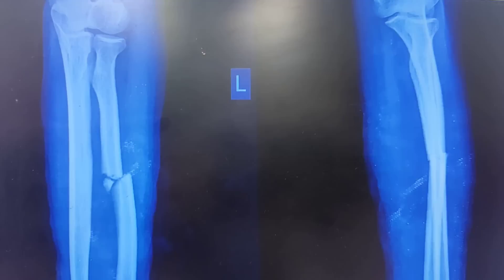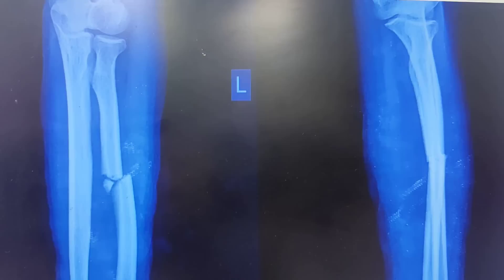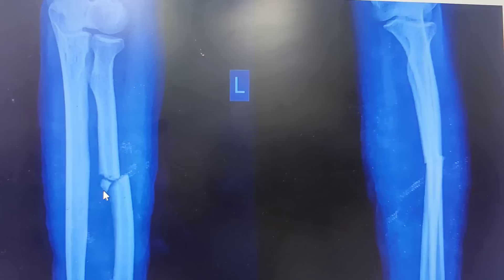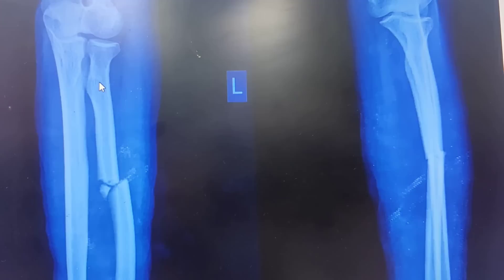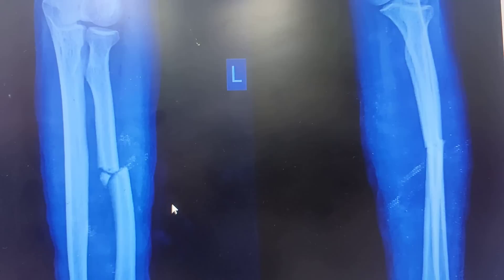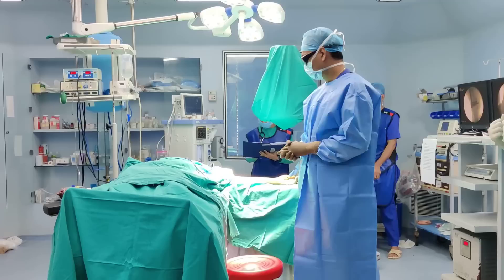Our patient today is a 48-year-old right-hand dominant gentleman who was involved in a road traffic accident and sustained an injury to his left radius around a month ago. As is very common in India, he was seen by a local practitioner and has presented to us with persistent pain. There is a multifragmentary fracture of the left radius. It is not very proximal, but the exposure will allow me to show you every single relevant anatomy for an anterior Henry approach for a proximal radius fracture, including how to protect the posterior interosseous nerve.